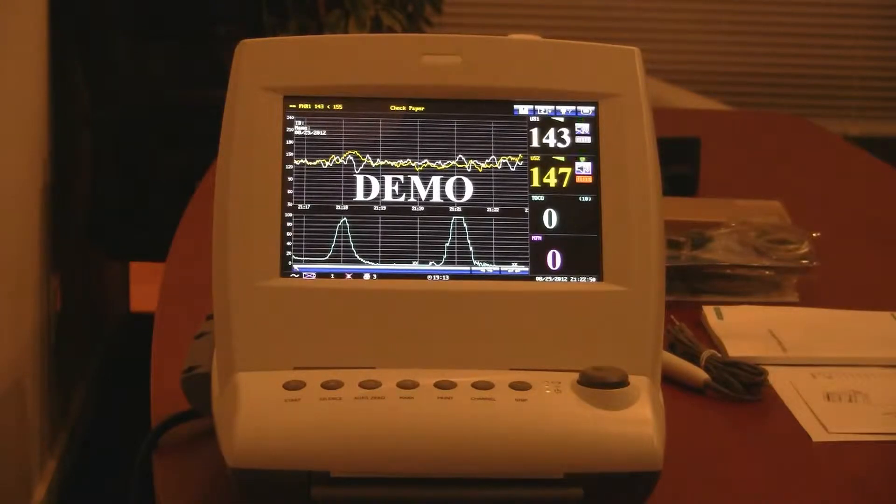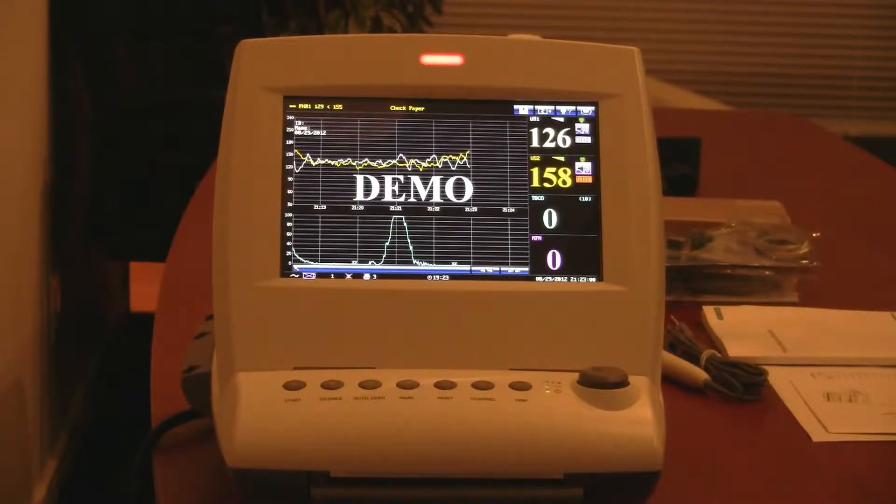It's got a fetal heart rate measuring range of 50 to 240 beats per minute. It utilizes a 1 megahertz waterproof sensitive transducer. It's got signal overlap verification to differentiate between the twins' fetal heart rates, and a fetal heart rate quality signal indicator to make sure you've got proper probe position. It'll store internally 60 hours of built-in memory for seamless monitoring.